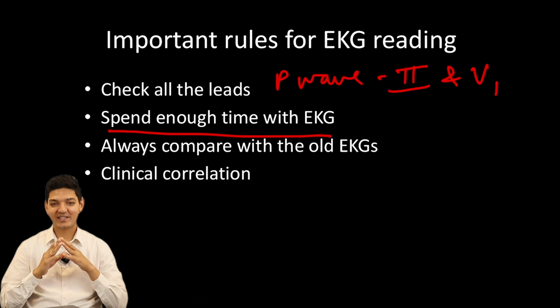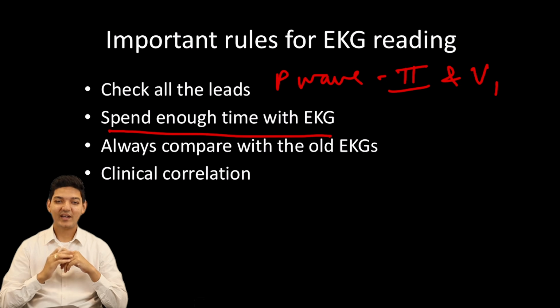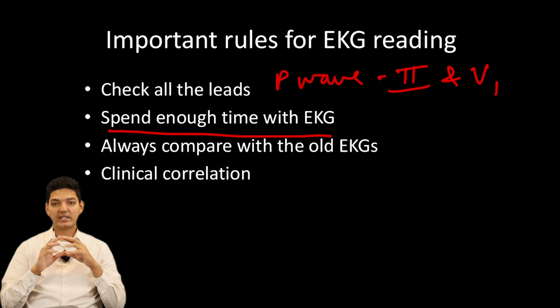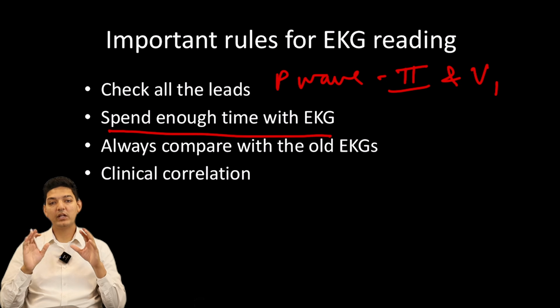Reading EKG is no less than an art, and if you spend 3 minutes, the EKG will start talking to you. If you spend 5 minutes with the EKG, it will start screaming at you. And I can tell you something, no one will diagnose you with schizophrenia because of that. Alright, next 2 points are always compare with the old EKGs and always clinically correlate.